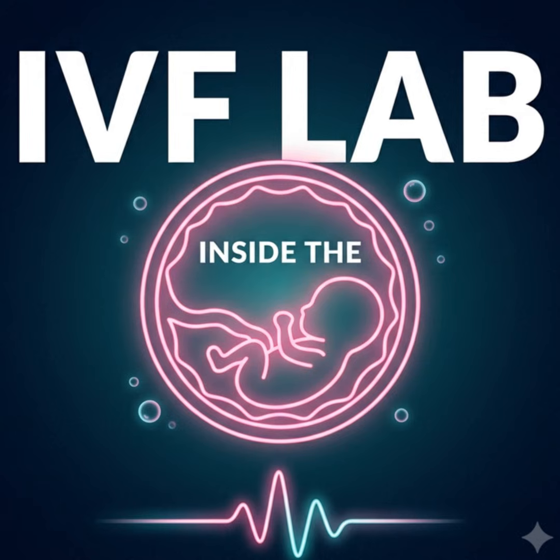But you cannot achieve vitrification just by dropping the temperature quickly, right? No, unfortunately not. If an embryologist took a completely untreated oocyte fresh from the incubator and plunged it into liquid nitrogen, even at negative 20,000 degrees a minute, the sheer volume of water would still form ice and shatter the cell. Exactly. The water volume is just too high. So to achieve the amorphous glass state, the embryologist has to fundamentally alter the internal chemistry of the cell before the freeze. We have to severely dehydrate the matrix.